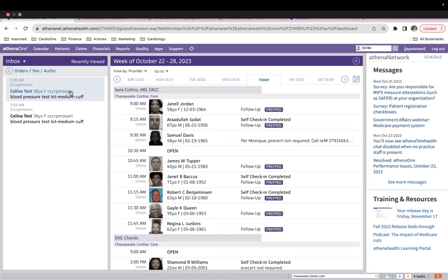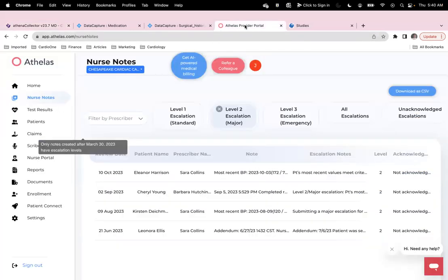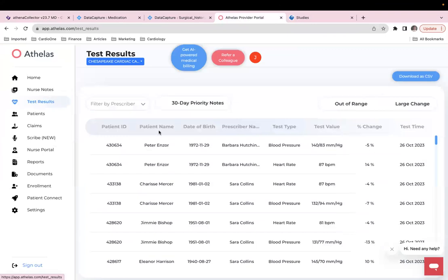Once they do that, they enroll them, then the devices get shipped to the patient, and our RPM partner will provide the outsourced service for making sure that the devices are getting shipped to the patients enrolled. Then once the patients are enrolled, they onboard them, and we have all of their vital signs tracked through this application.